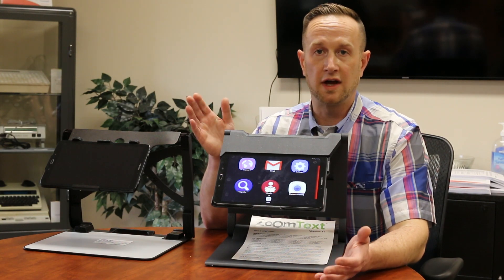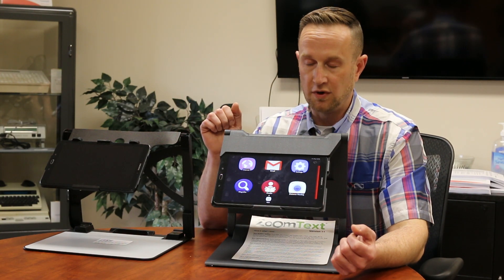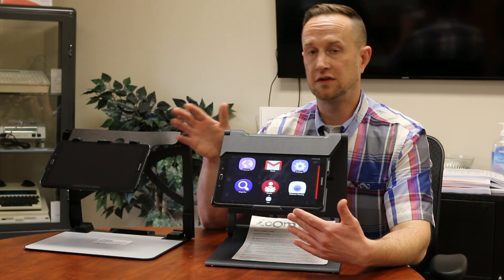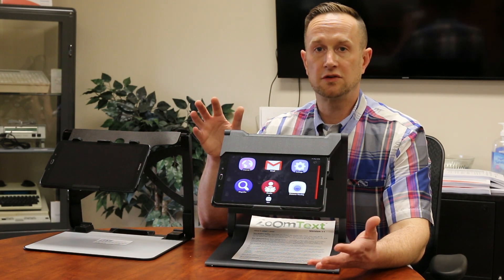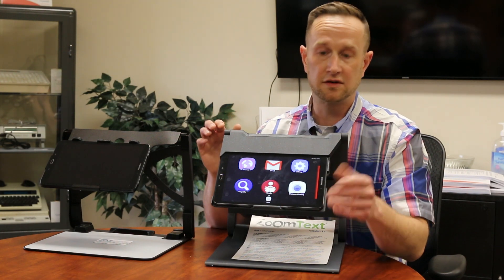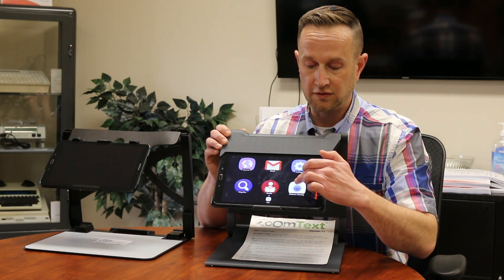You can turn on the reader and have it read out loud, so you can have full page OCR — it does a full page at a time. If you want, you can save that image and have it stored on the device. You can transfer that image, send it to a computer, or text it to yourself. You can essentially take a picture of any page, have it read out loud, and then send or save it in a variety of different formats.